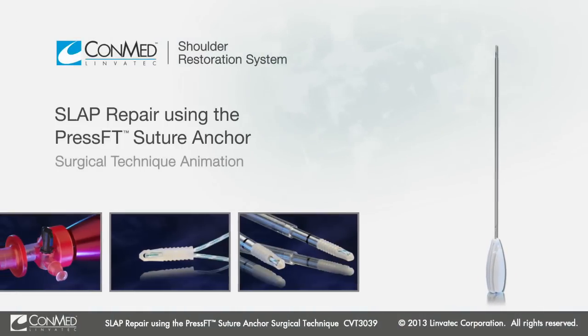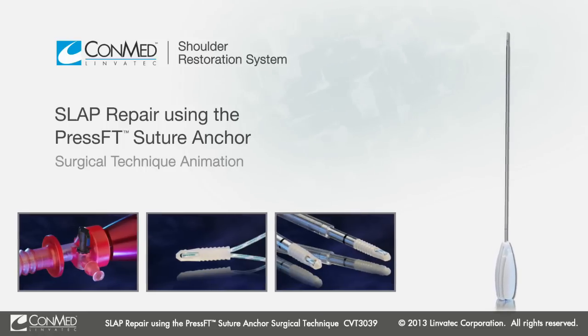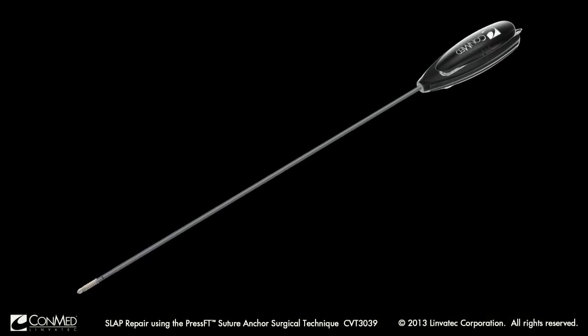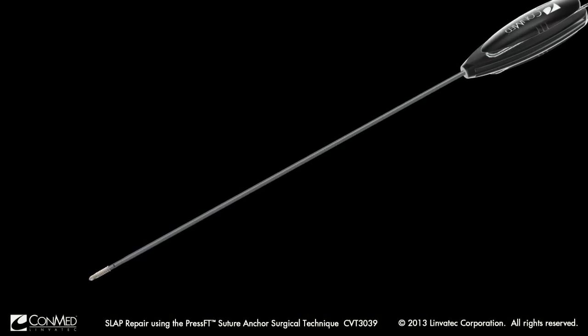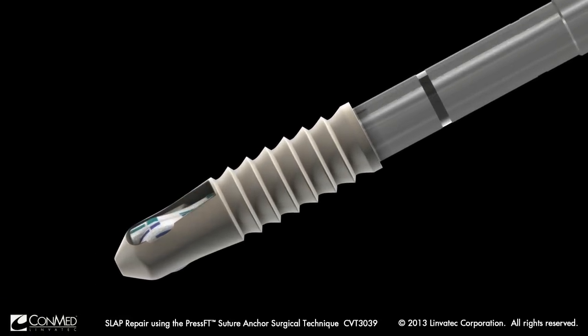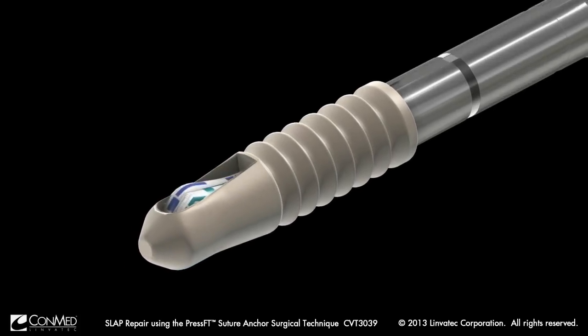Presenting a technique for superior labral repair utilizing the PressFT Suture Anchor from ConMed Linvatec. This anchor is available in both Peak and Genesis biocomposite materials. The PressFT used in this procedure is double loaded with HiFi high-strength polyethylene suture.